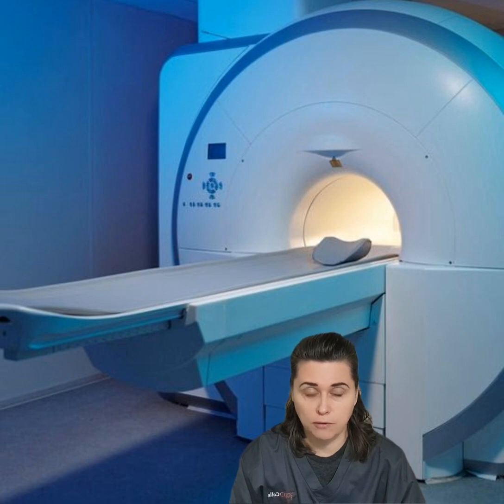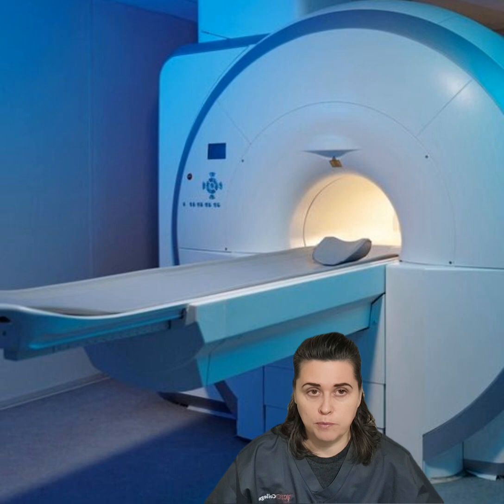It depends on how many lumbar vertebrae our patient has, and we will be slicing them one by one and adjusting our angle, making sure we capture the whole vertebra one by one.